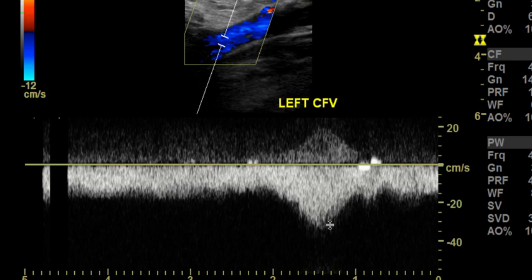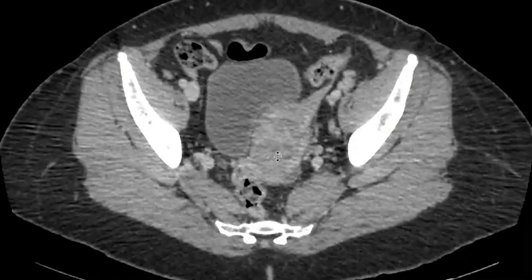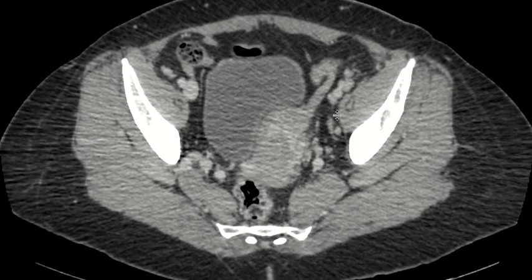This is when they squeeze the calf to see if there's patency between the calf and the common femoral vein. So that's why we get this little blip right here on the spectral waveform. But overall, the spectral waveform is much flatter compared with the other side. This patient ended up getting a venogram that was performed to look for something more proximally occlusive.